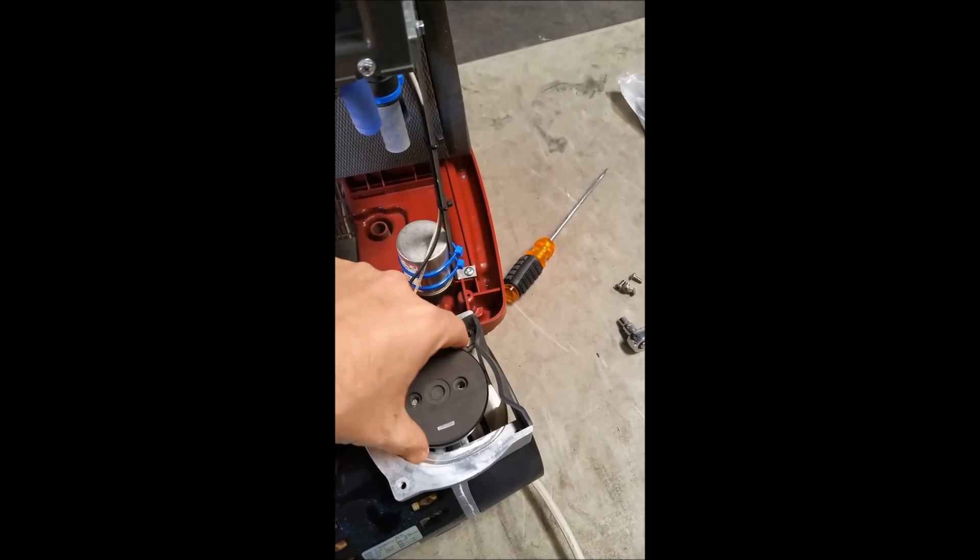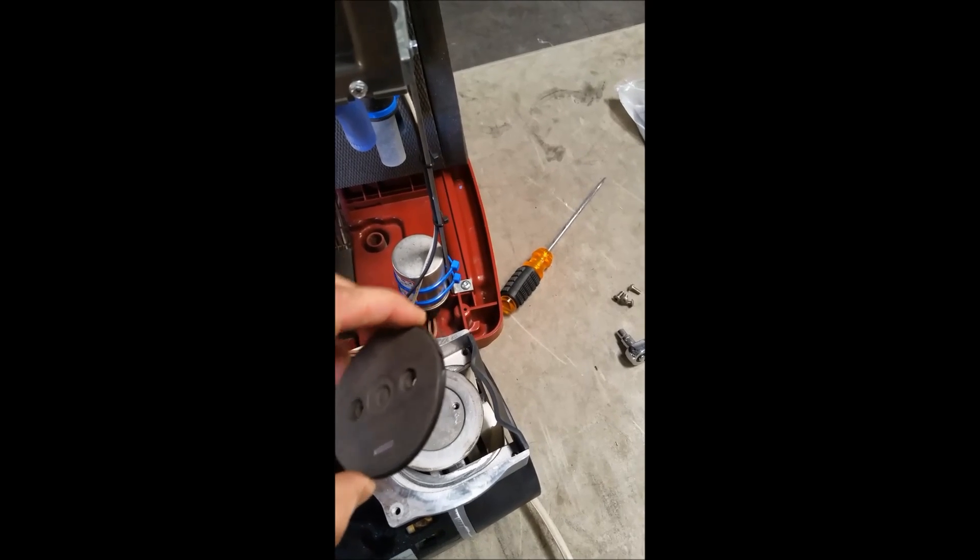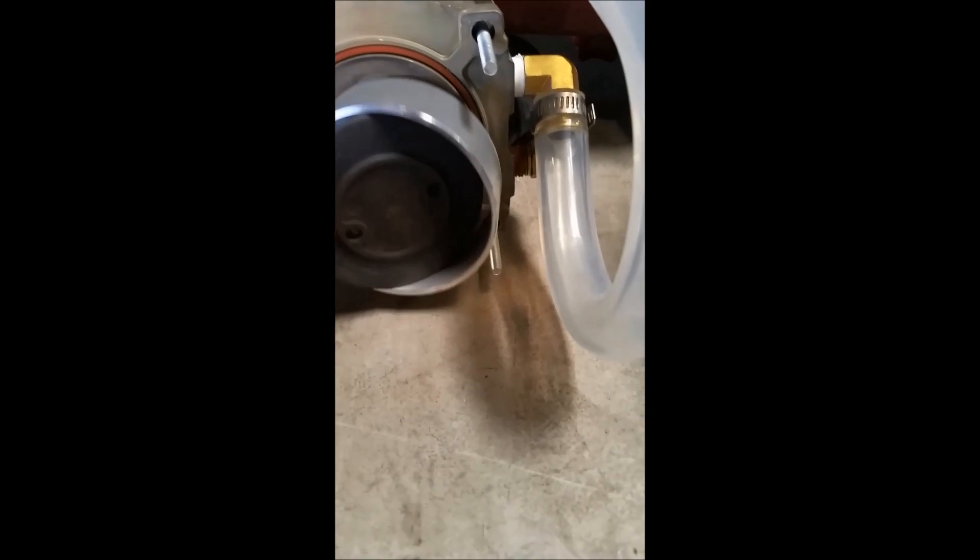If you're interested in what's making all the noise, you'll see right here that we're going to remove these. There's a seal on the side of this gasket. Basically, inside your housing it's wiggling around once the seal is older — so that's what you're hearing.